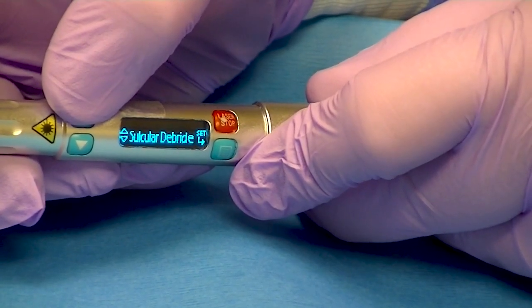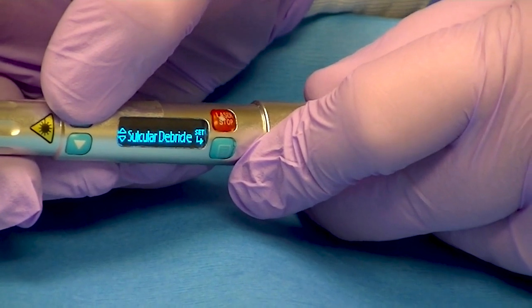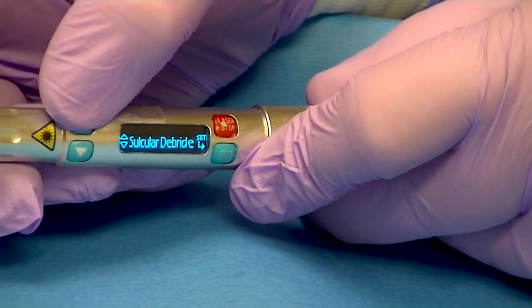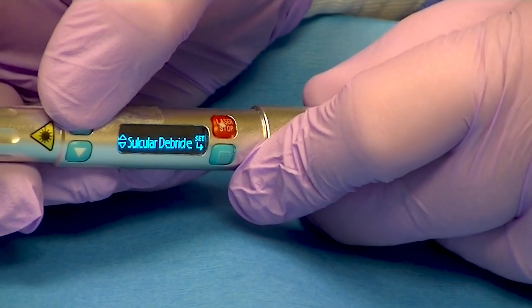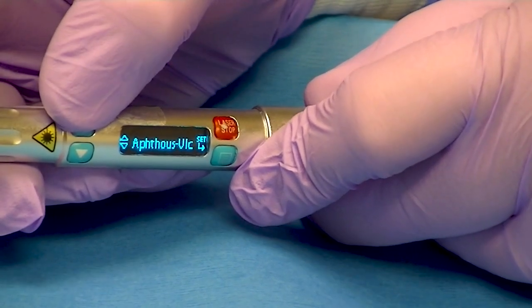Sulcular debridement — our hygienist loves this for decreasing the bacterial count subgingivally. We've gotten remarkable results and diminished or decreased pocket depths using the diode lasers. Our patients are very responsive to this, most of the time done without anesthetic, although you can use it with anesthetic.